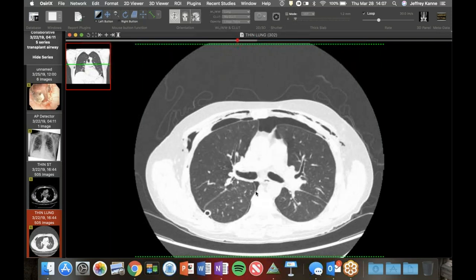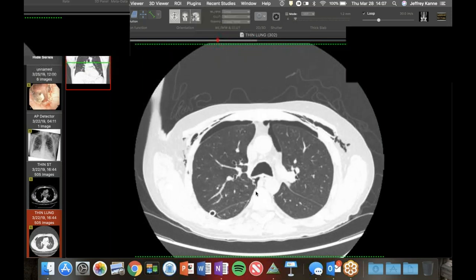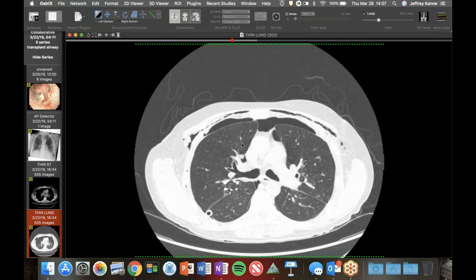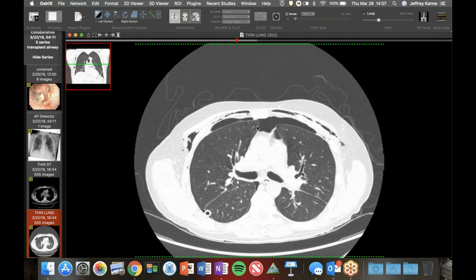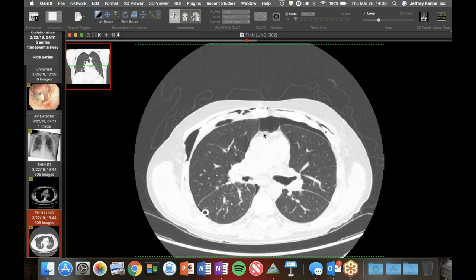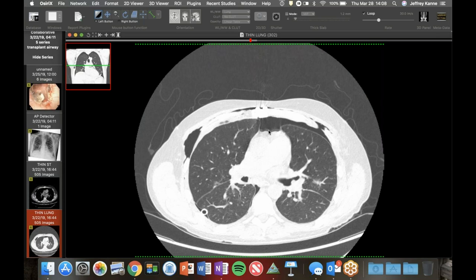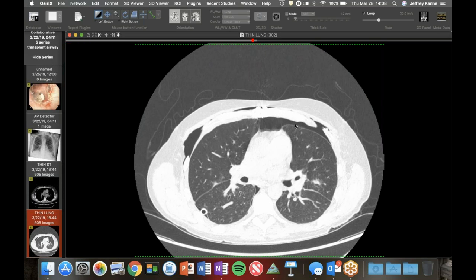It's not uncommon to see a little bit of overlap like that. But right down at the bronchus intermedius, there's a little gap, and you can see it communicates with the pleural space as I scroll through. That is the presumed air leak. What else is cool - it's not uncommon with a clamshell to have a common pleural space down where they open the sternum up.